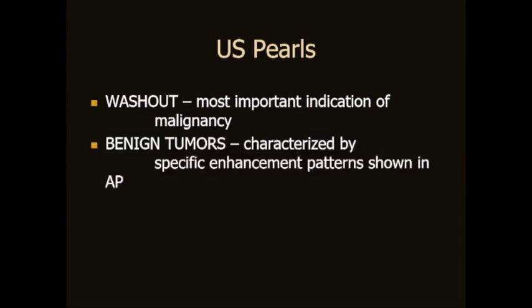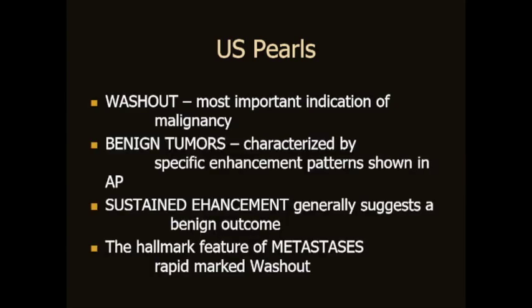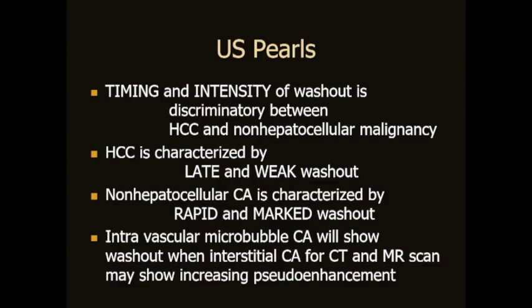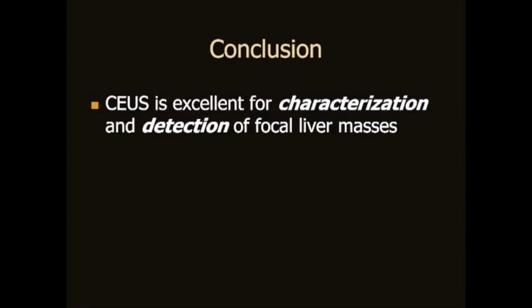Now, so the ultrasound pearls that I've shown you are all reproduced in my syllabus, and if you're interested, they're there, and I'm just going through them right here. And so in the interest of time, I won't repeat them, but I believe if you understand all of those things, you'll do exemplary. Peter Burns and I made a mistake on everything when we were starting, trying to work out all of these rules. And so I hope that my sharing them with you will be helpful.